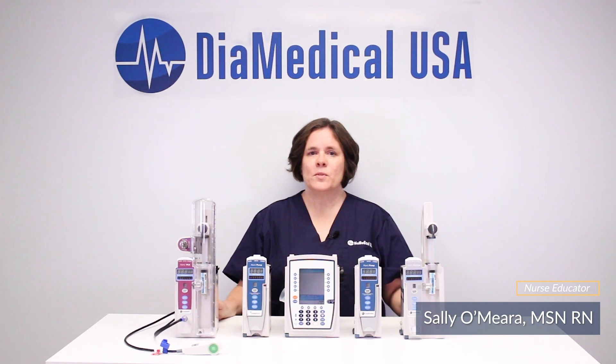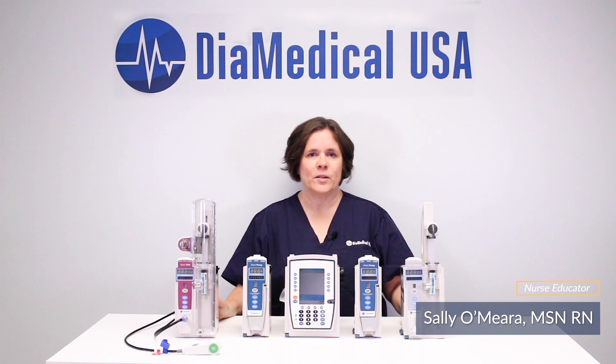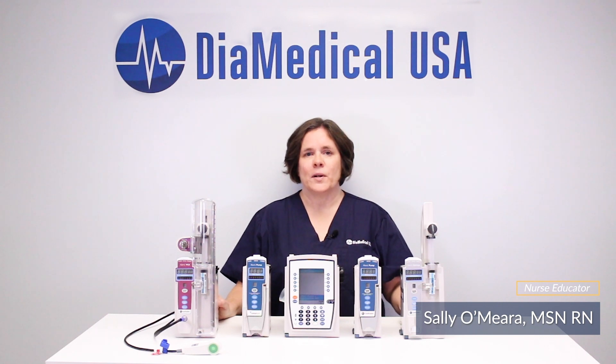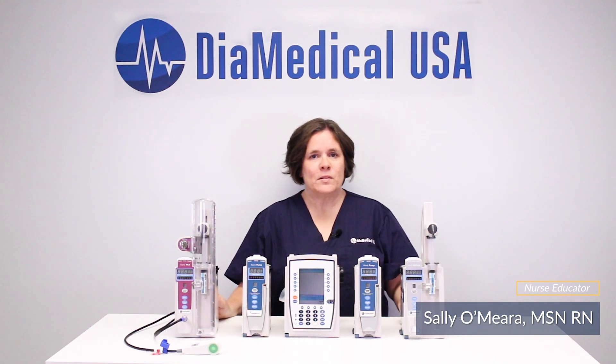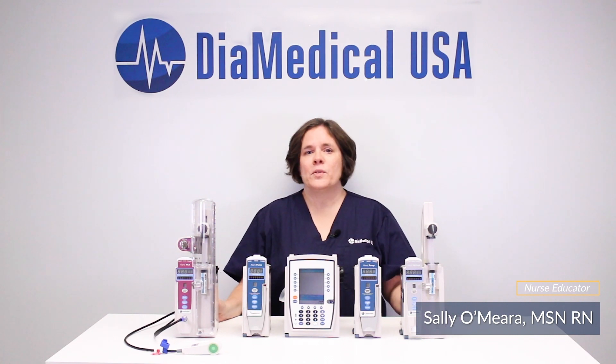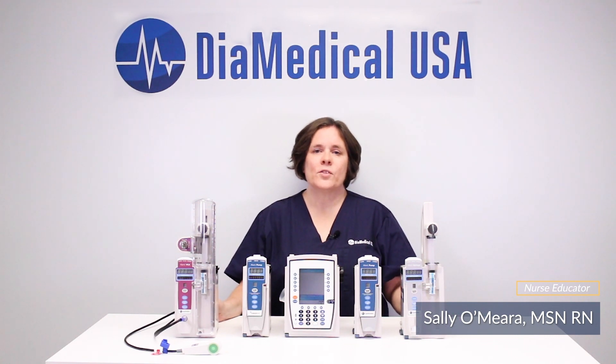The Alaris Medley system uses guardrail software to protect patients from IV medication errors. The DIA Medical USA Educational Drug Library is an abbreviated version of guardrails that was specifically designed for training. It helps students learn how to program Alaris pumps for both primary and secondary infusions. Clinical advisories even alert students to special precautions that are needed for certain medications.